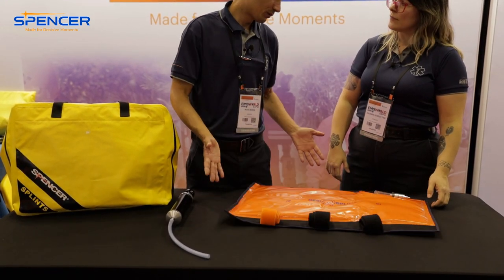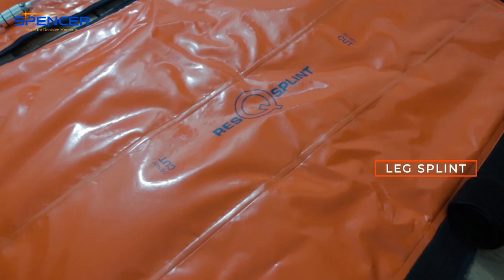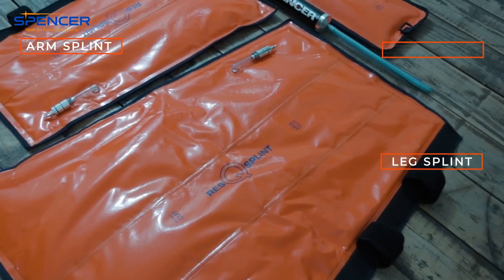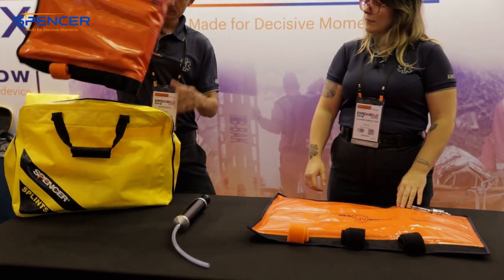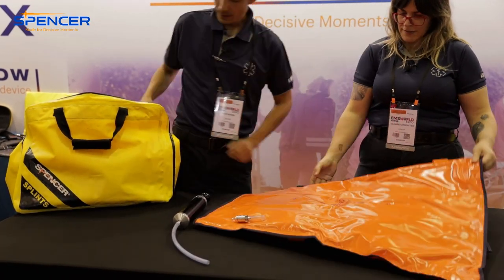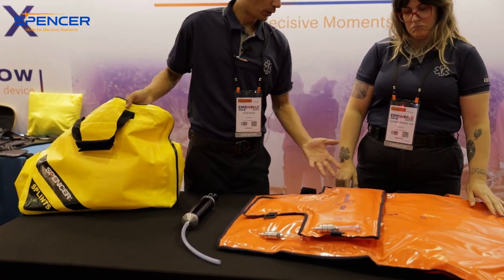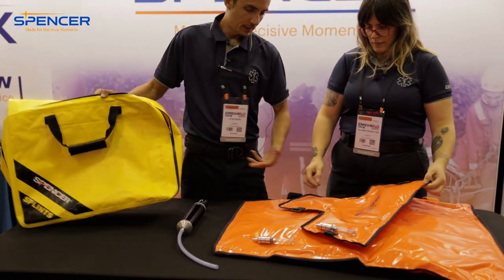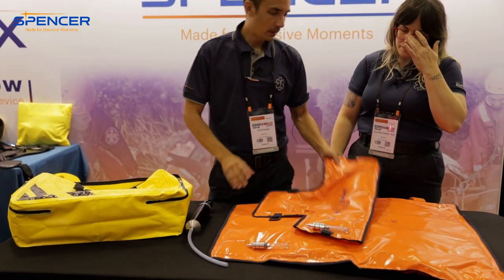This one's for the arm or a leg, it really doesn't matter. There are three different sizes that come in a kit — this could be like an arm or somebody's small leg, there's a bigger leg size, and then this could be for an ankle or a foot. And then you get this cool carry bag.